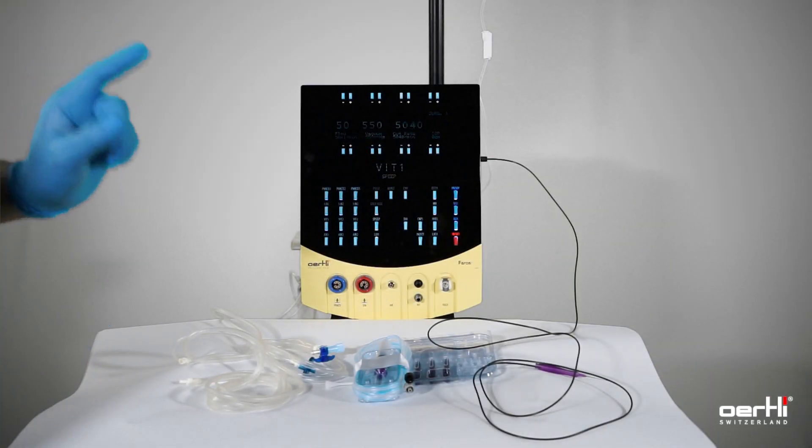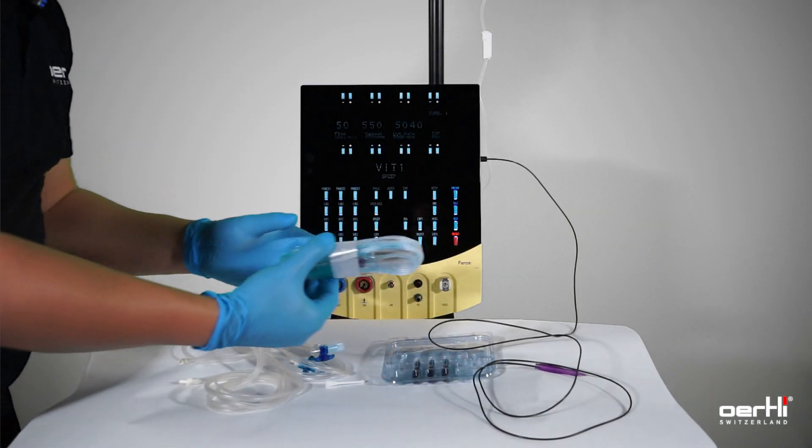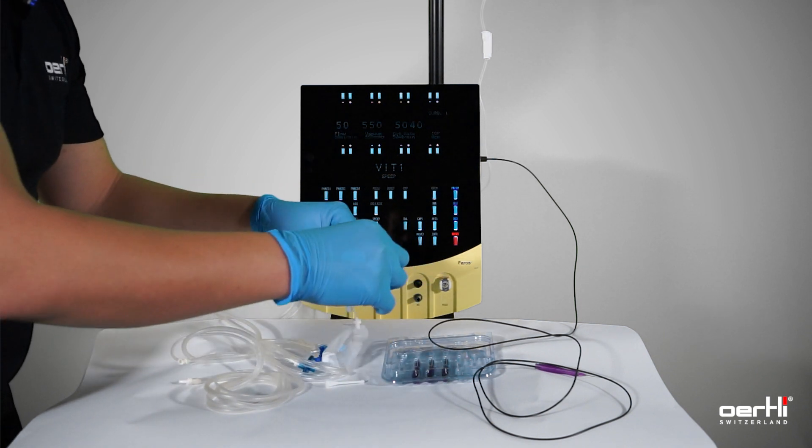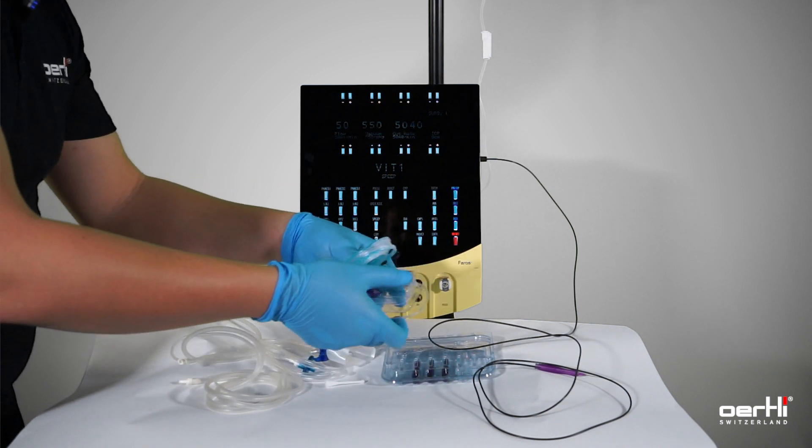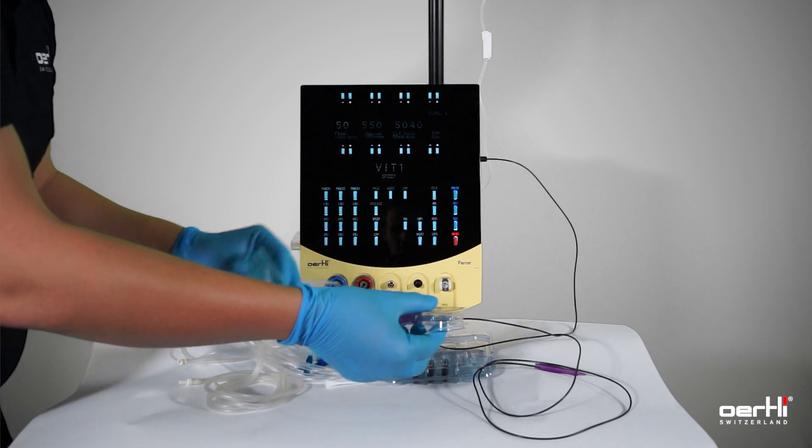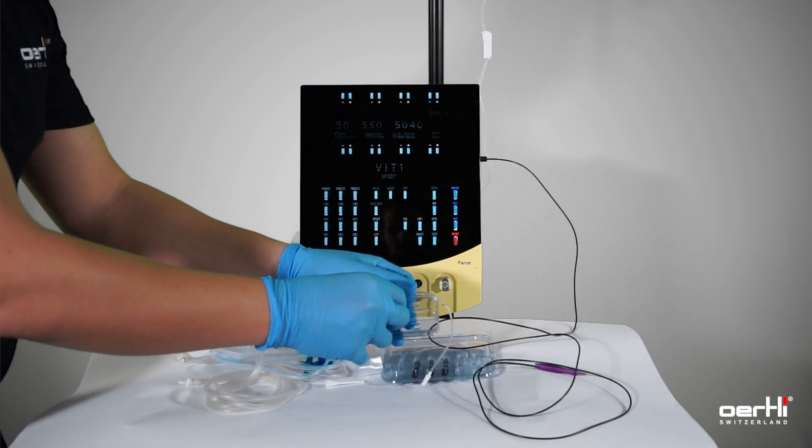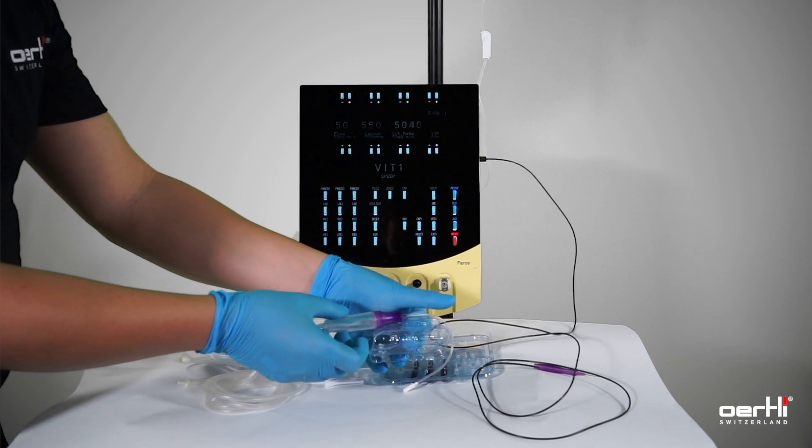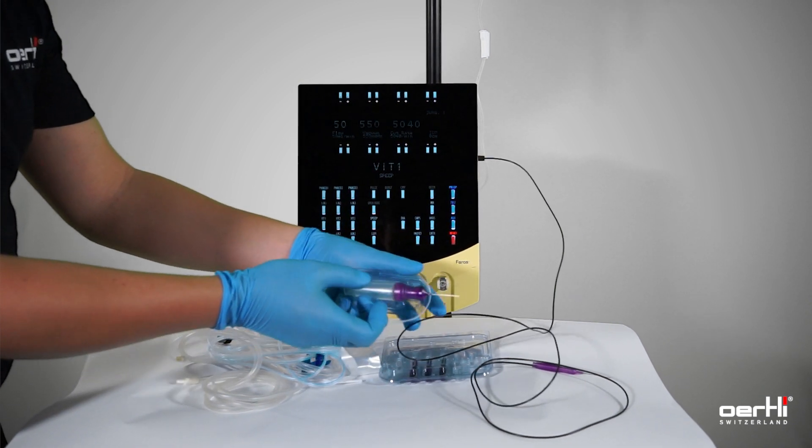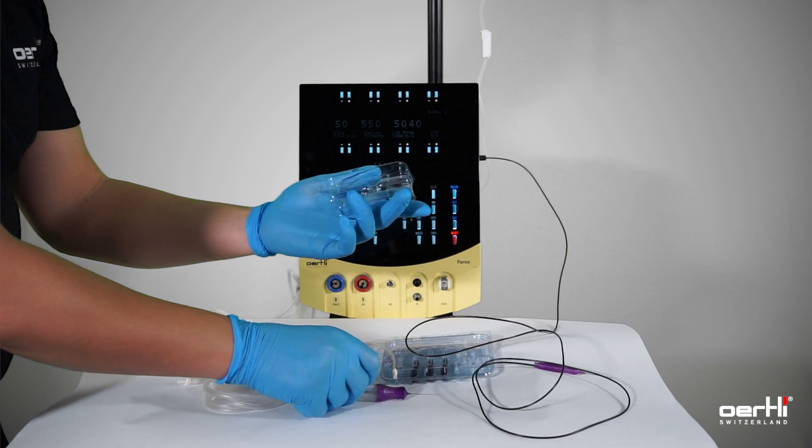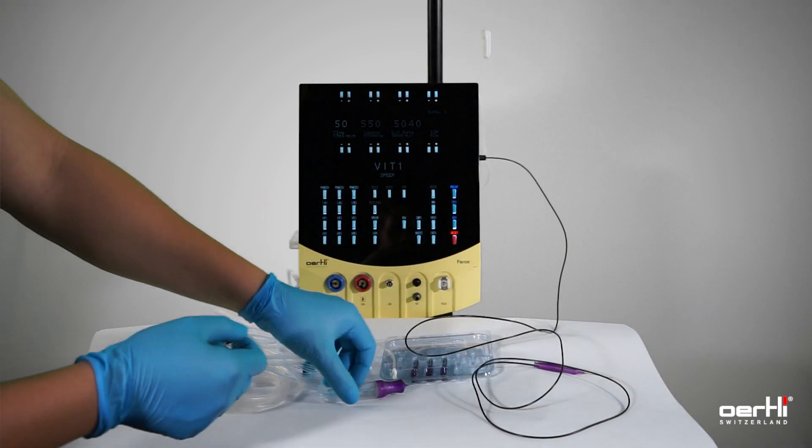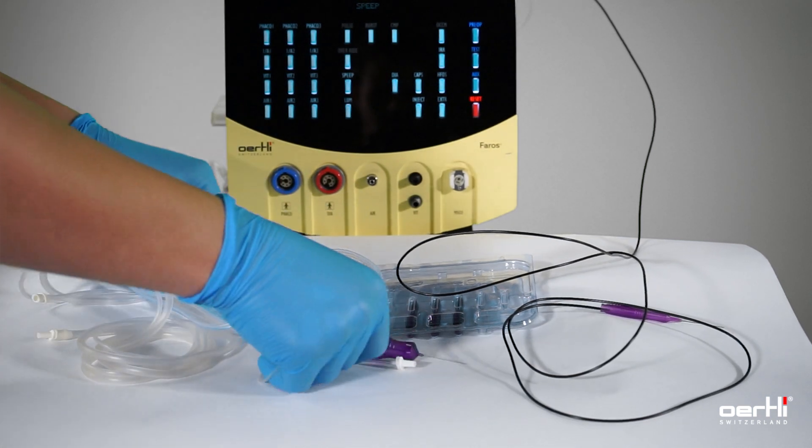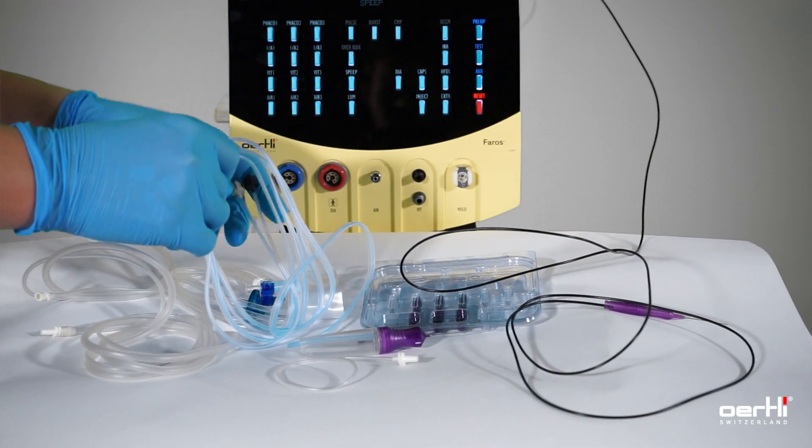Next, the cutter. Remove the wrap, take the handpiece out of its cover. Be careful, don't bend or damage the cannula. Scrap the plastic and connect the cutter.